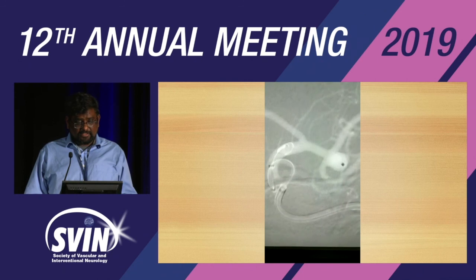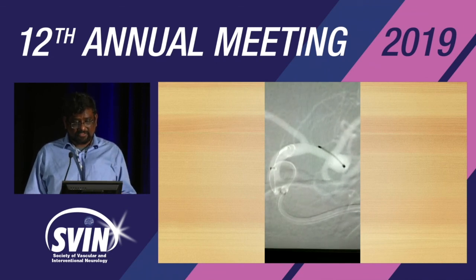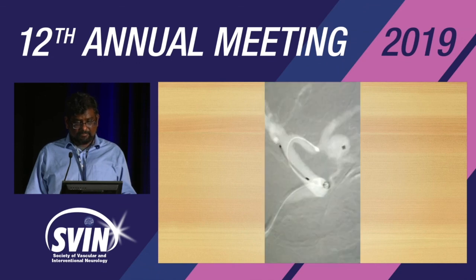So here, as we advance up, I'm going to tell you a couple of things. One, he has a lot of experience, so he's going straight in. But typically, you stop at this time and do a roadmap again to see how the anatomy has changed. So now he's tip to tip.